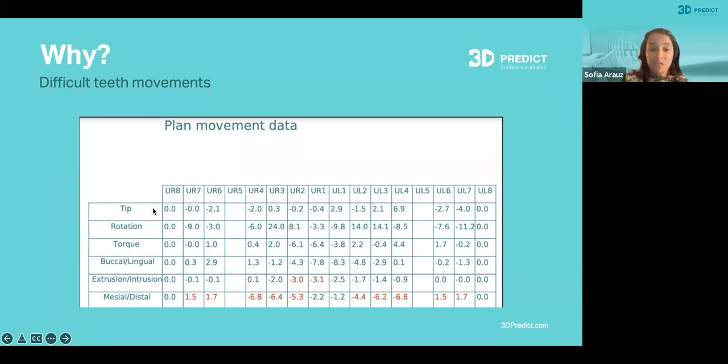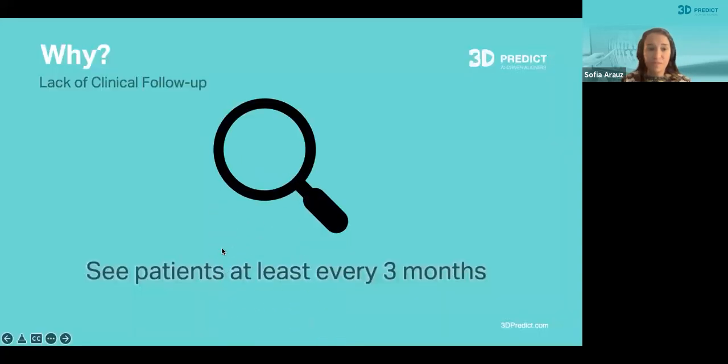This means you might need a refinement at the end of the treatment. We might not be able to achieve this volume without elastics, or this is completely violating the patient's anatomical boundaries, and thus you're going to have periodontal issues down the line. But our technicians will let you know which one of those three it is.